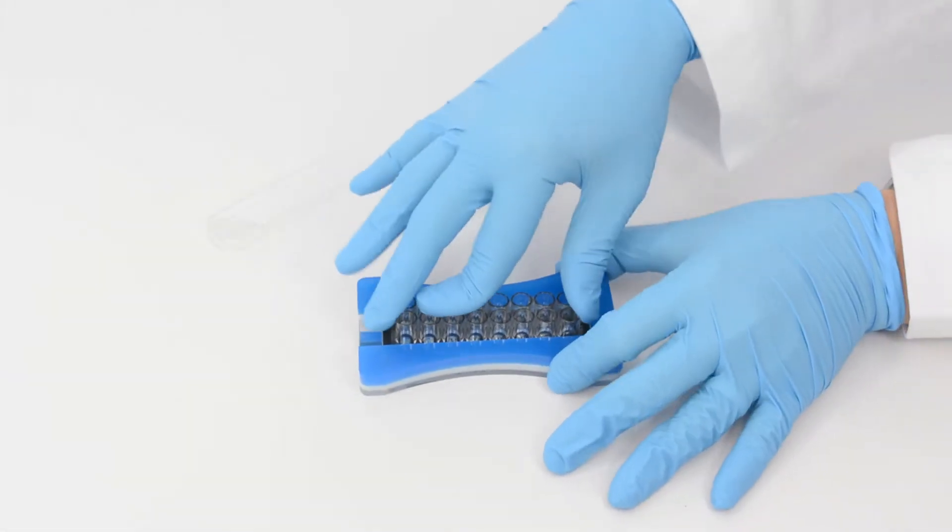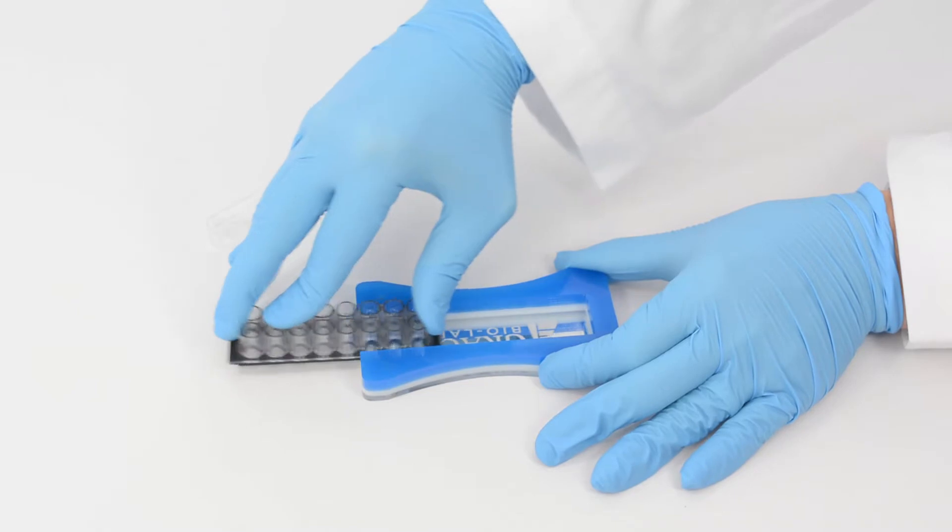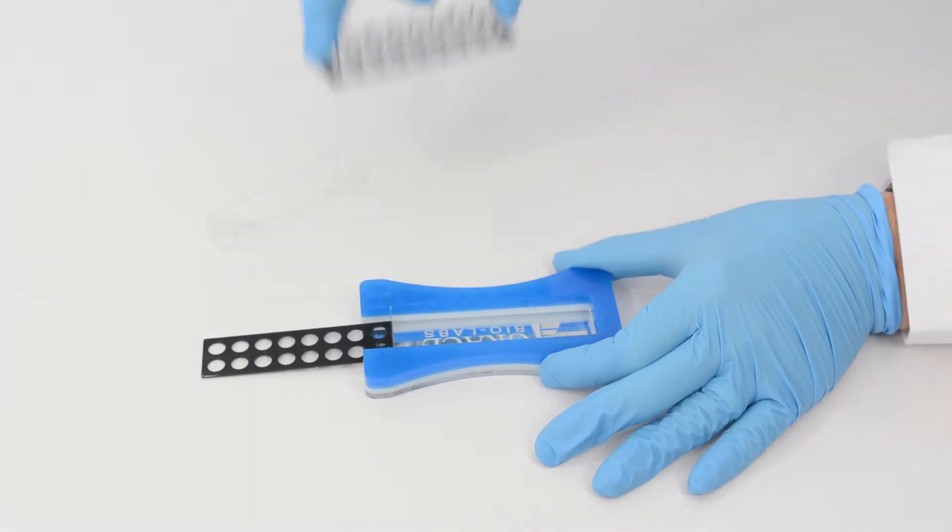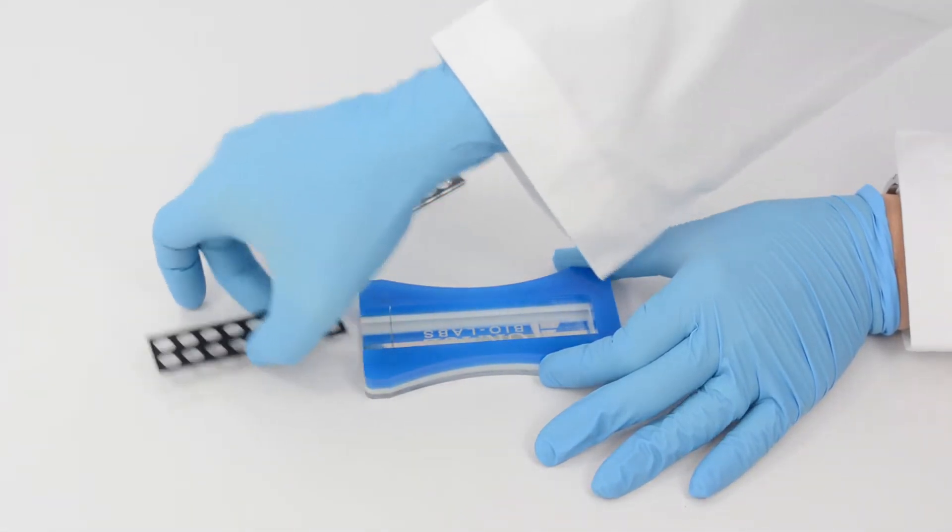Gently move the chambered coverglass through the removal tool. Multiple passes through the removal tool will separate the gaskets naturally.